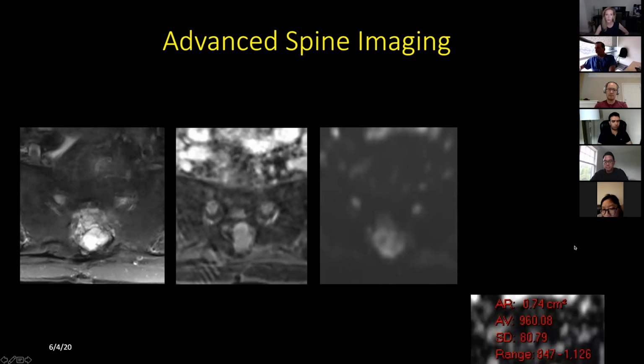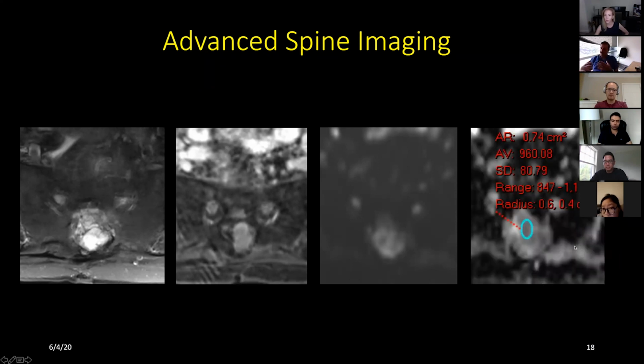I can't really go into all the advanced imaging techniques and how it is done in this lecture, but just to give you an idea, this is an ADC value that we go by. Usually in the bone world, we are comfortable with an ADC value of 1500 and above, and anything less than 1500 makes me really nervous. And this was 960. So that is very, very ominous.